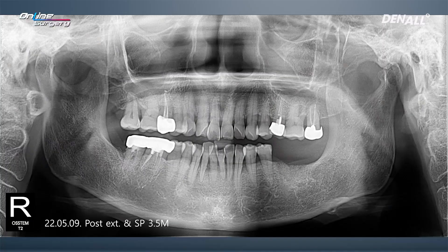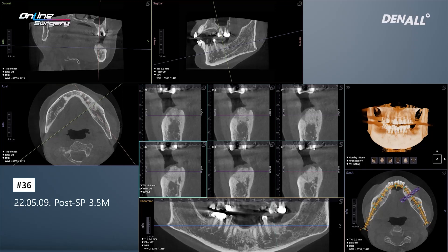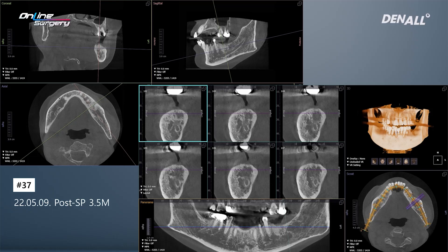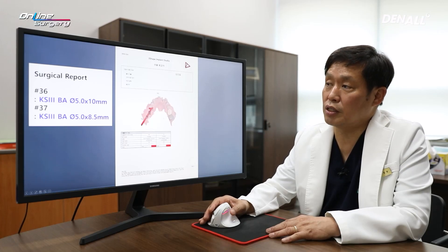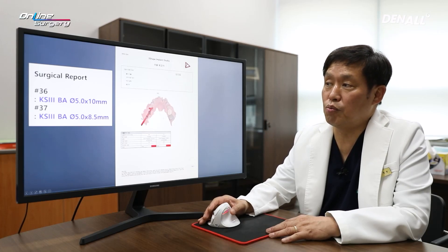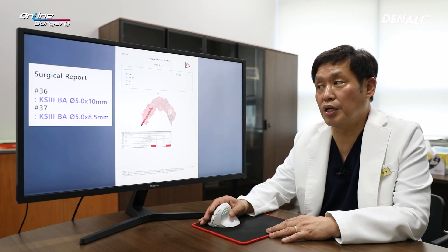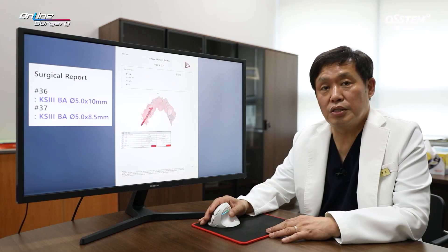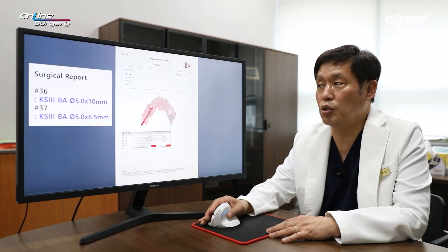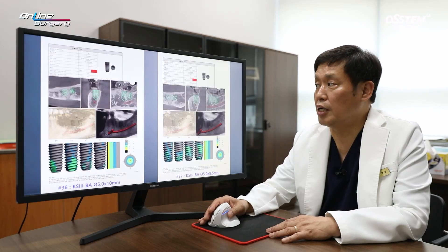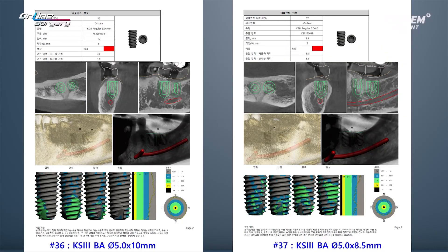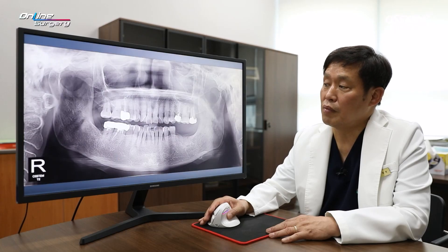This is about 3.5 months later. Socket preservation was done 3.5 months before, One Guide surgery was prepared, and CT was taken. You can see that the graft material has matured. I consulted with the One Guide team: in number 36, KS-3 BA 5.0 x 10 mm and in number 37, BA surface KS-3 5.0 x 8.5 mm were planned. The distance with the inferior alveolar nerve seemed quite close in the distal case.